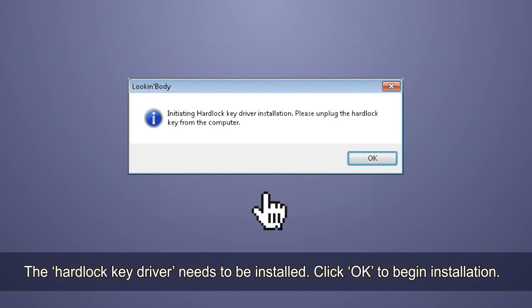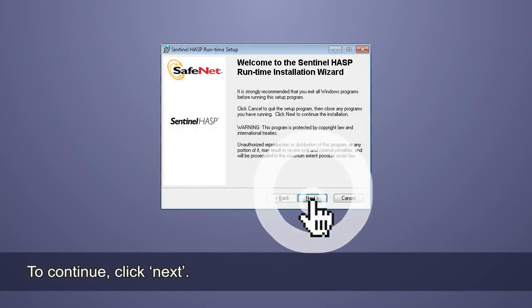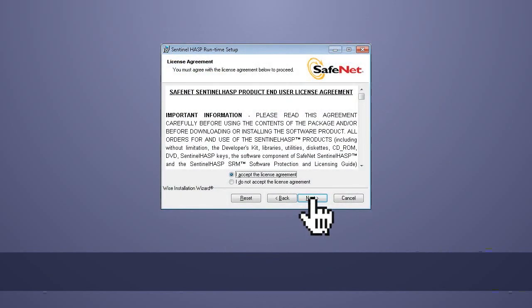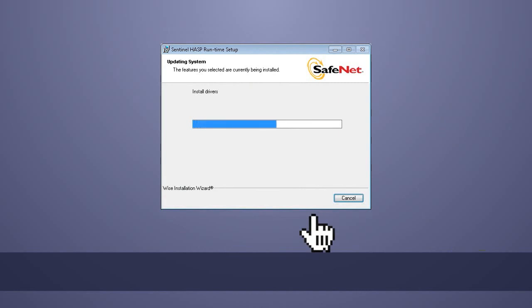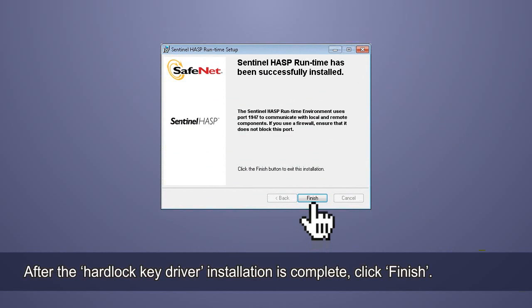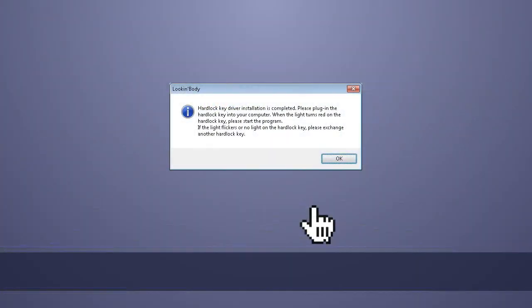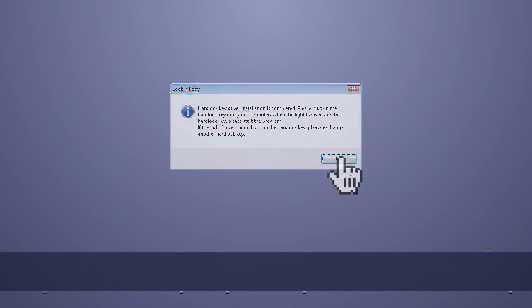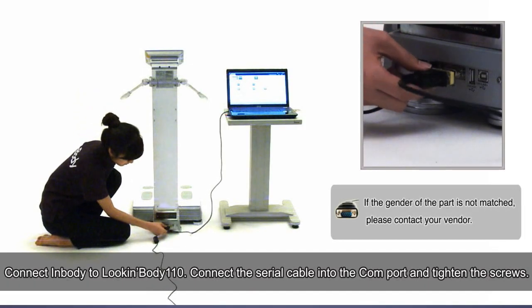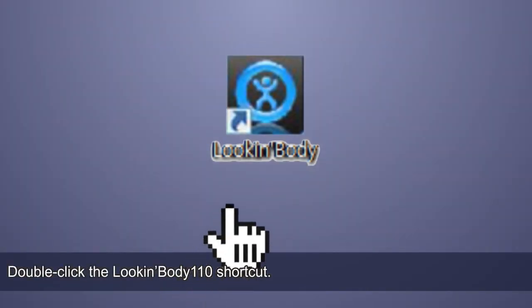The hardlock key driver needs to be installed. Click OK to begin installation, then click Next to continue. After the hardlock key driver installation is complete, click Finish. Insert the hardlock key into an open USB port on the PC to start Look InBody 110. Now connect InBody to Look InBody: connect the serial cable into the Comp port and tighten the screws.